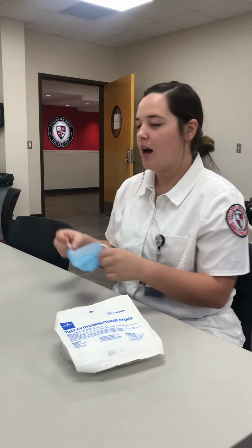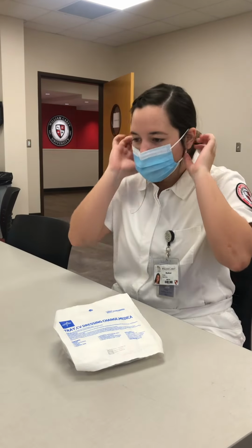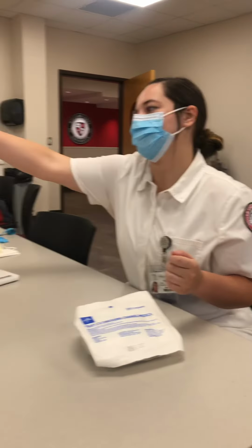So once I identify my patient in the physician's orders, I'm going to wash my hands, and I'm going to don clean gloves and a surgical mask. I'm also going to give the patient a surgical mask if they need it. They would need it if they aren't allowed to turn their head away from you. So any contraindications with the patient turning their head, they would need a surgical mask as well. So we could give them one.